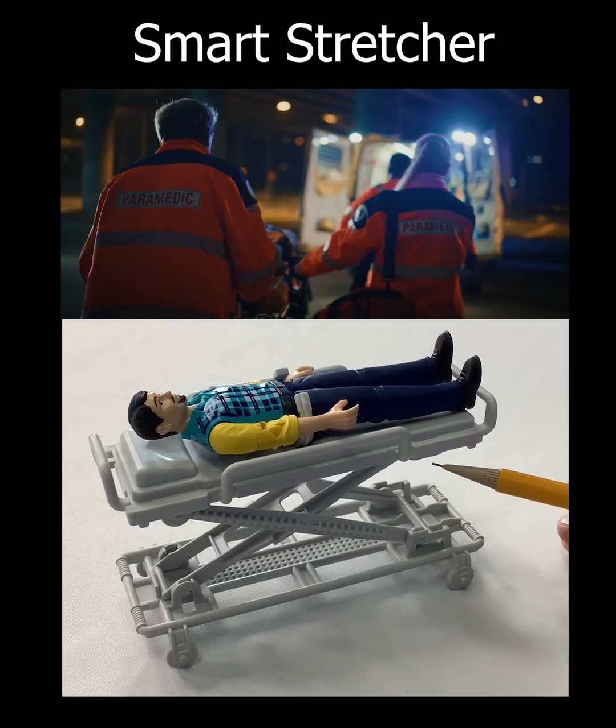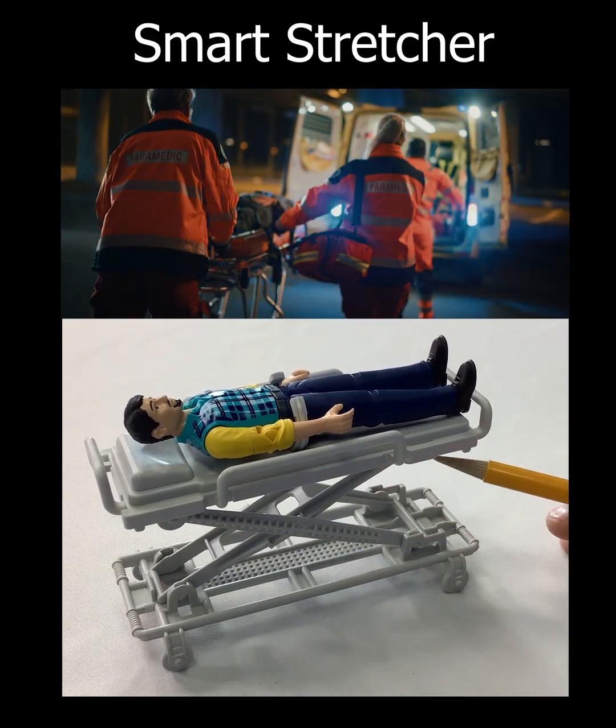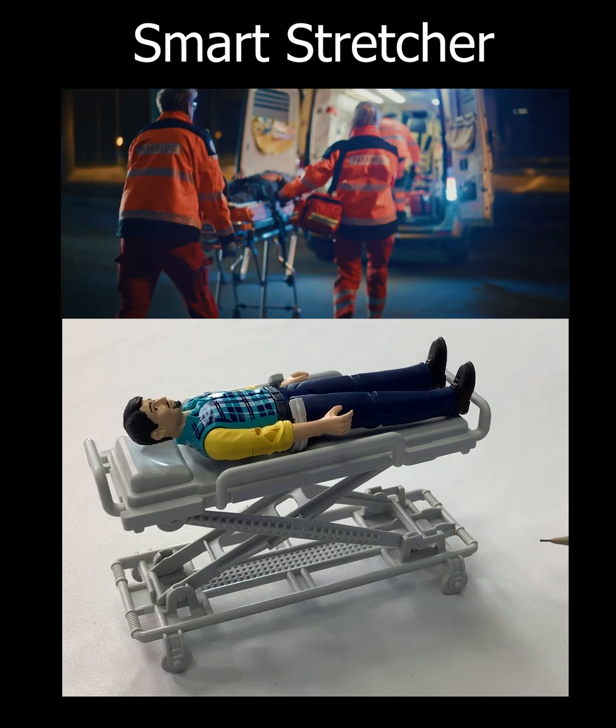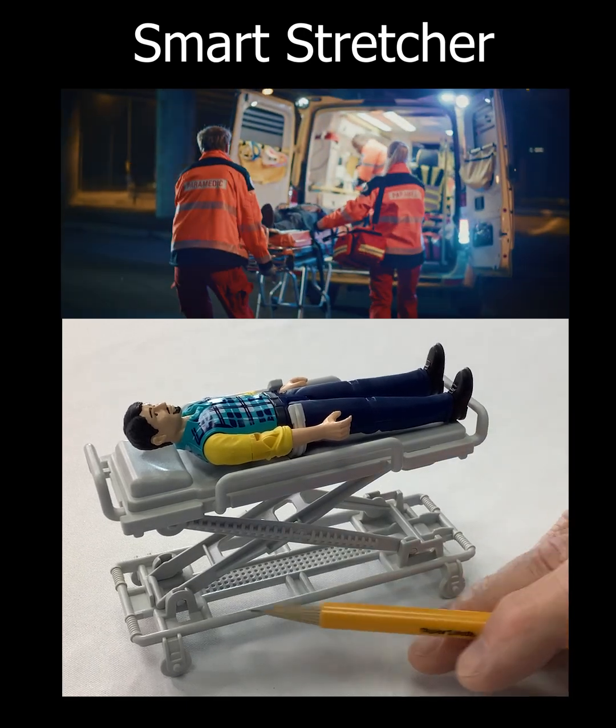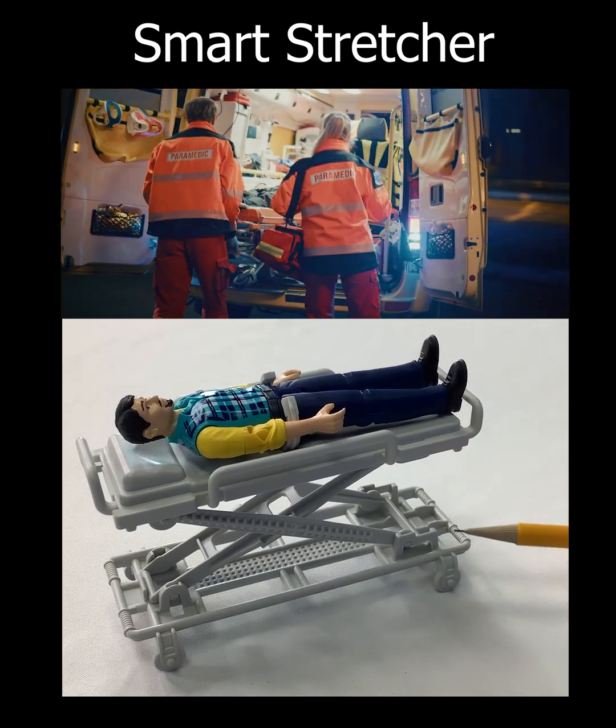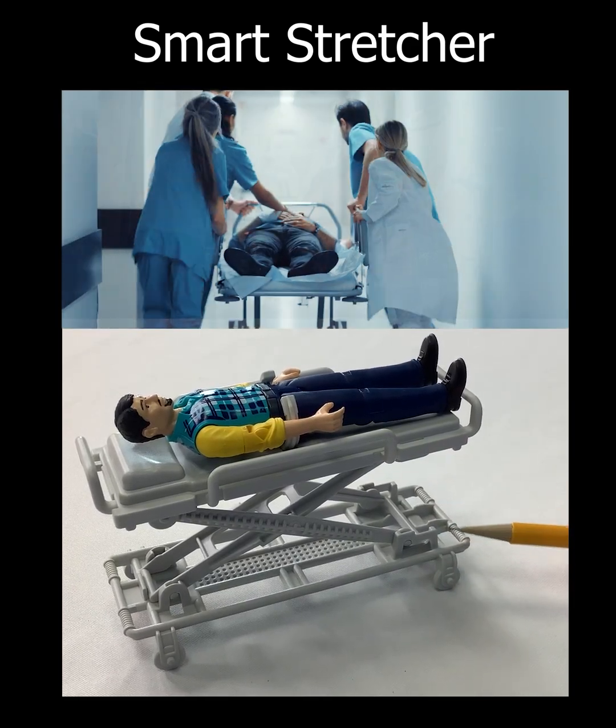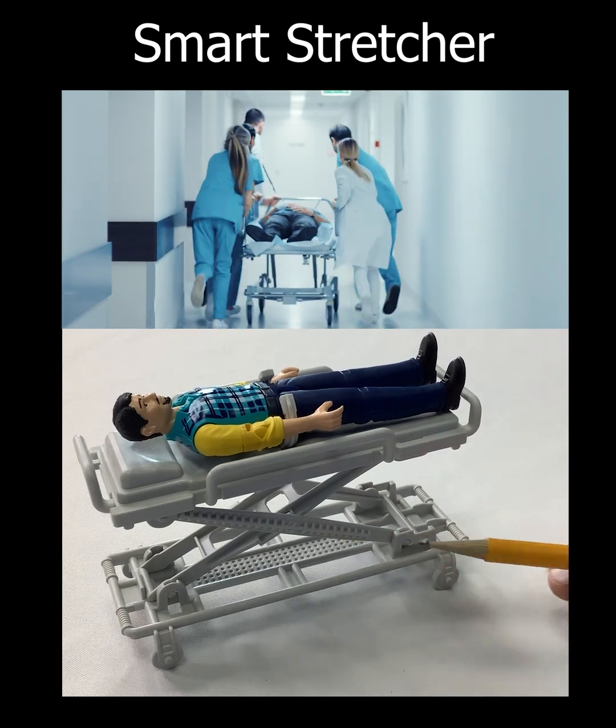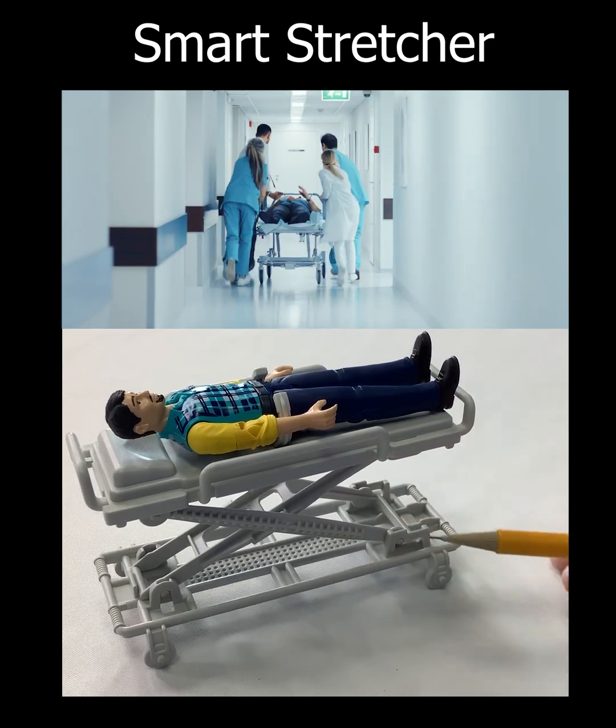The load cells generally are placed underneath the patient area because it gives you the most resolution. You can place them down in the feet. It weighs the entire scissor lift, but you lose some of the accuracy of taring off the weight of all of the stretcher.